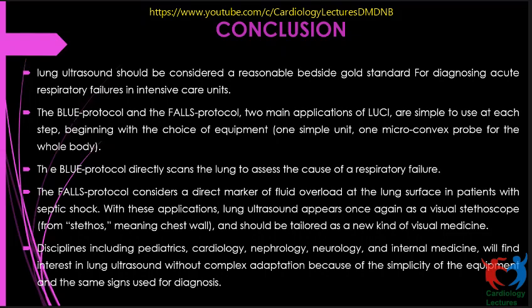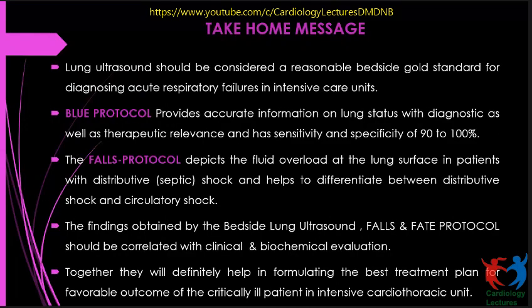Disciplines including pediatrics, cardiology, nephrology, neurology, internal medicine, everybody can use this particular modality for adaptation to treat their patients and come to a specific diagnosis for a specific treatment. The take-home message is that lung ultrasound should be considered a reasonable bedside gold standard.